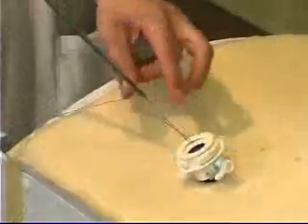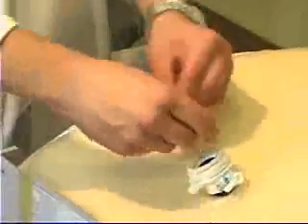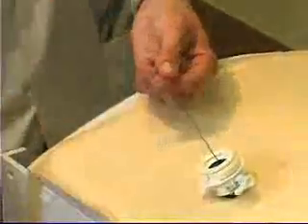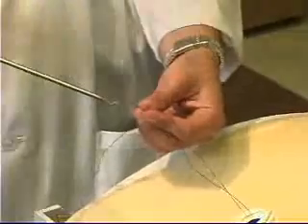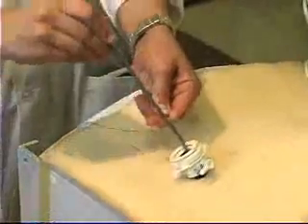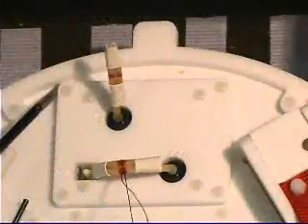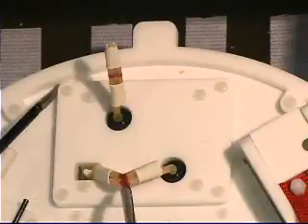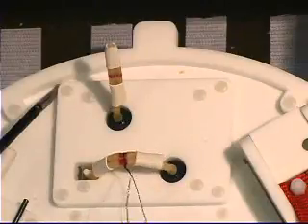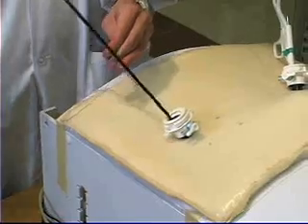The knot pusher is removed and a second throw in the same direction, creating a slip knot, is placed and the knot is cinched down again within the pre-marked area. Once 2 hitches are thrown, the suture is cut.